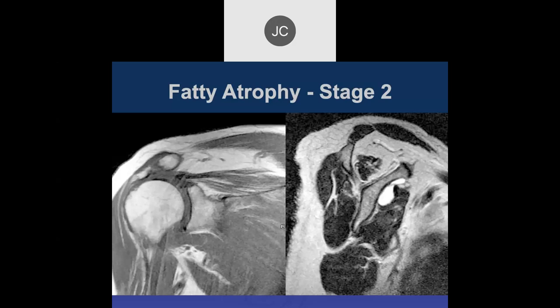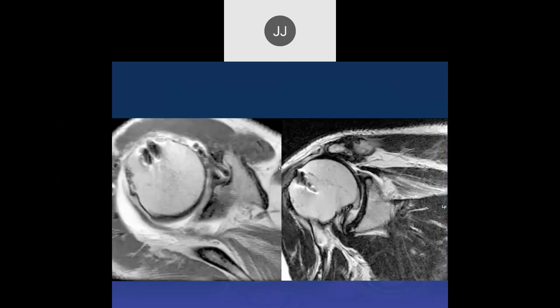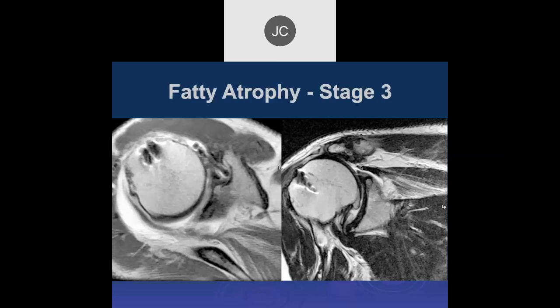Another case shows a retracted supraspinatus tear with a prior surgical anchor in the humeral head. Looking at the supraspinatus muscle, there appears to be about equal amounts of fat and muscle — Stage 3. The construct has failed and is retracted back. Stage 3 is generally not favorable for repair.